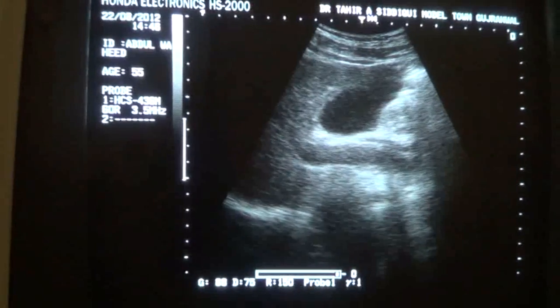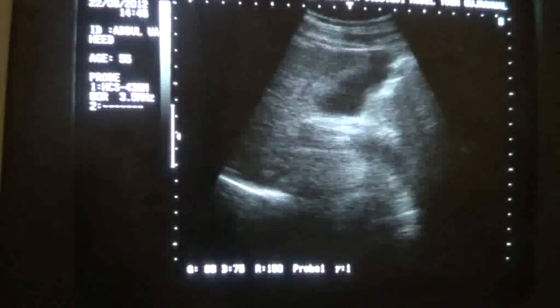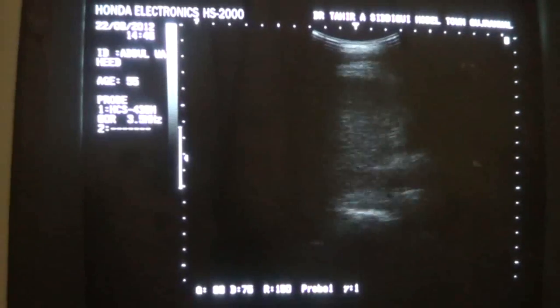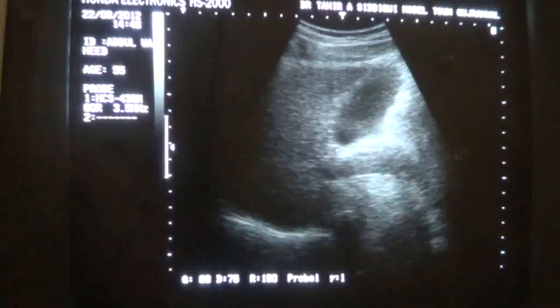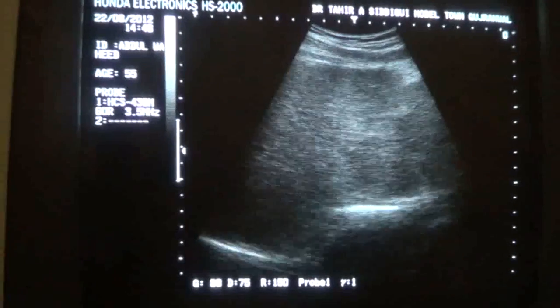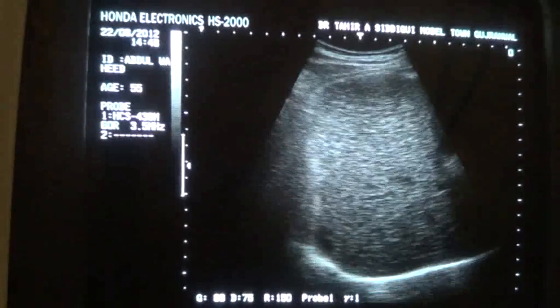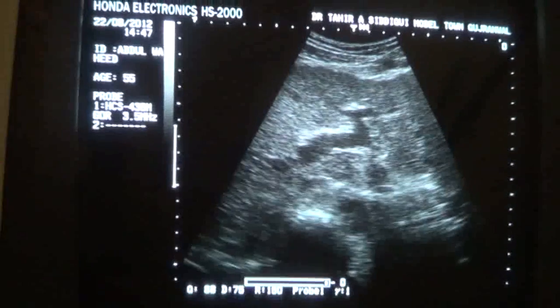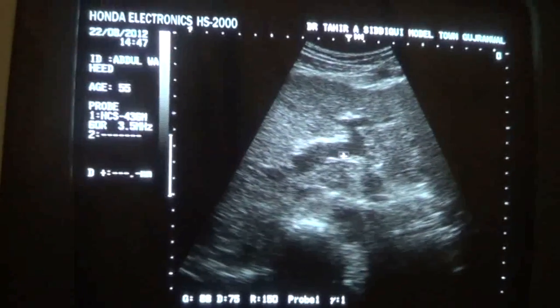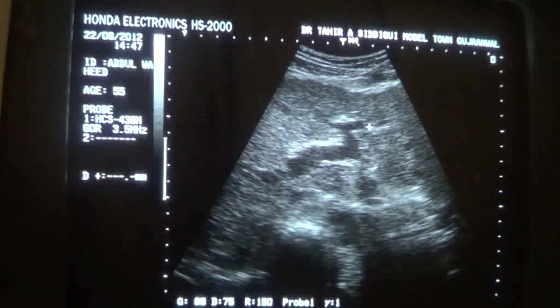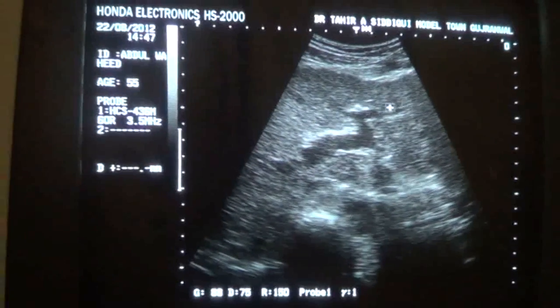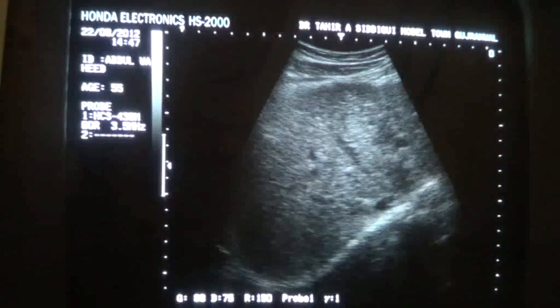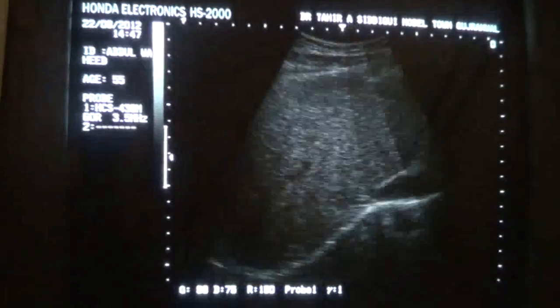Here the portal vein comes at right angles to the gallbladder. Now I am in the intercostal space trying to see parenchyma in any segment of the liver — I do not see any parenchyma in the liver, though the liver is of normal dimension. Here are the right portal vein, the left portal vein, the ascending portion of the left portal vein, the left ascending branch, right branch, left branch, and the right ascending branch from the ascending portion of the right portal vein. Normal caliber hepatic veins are entering the IVC.